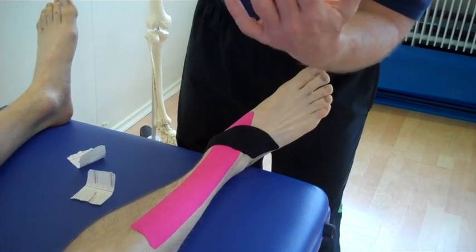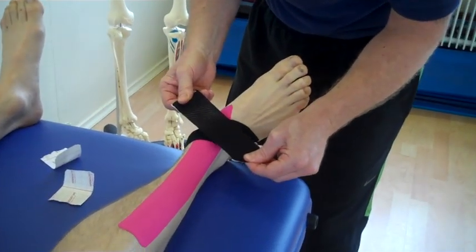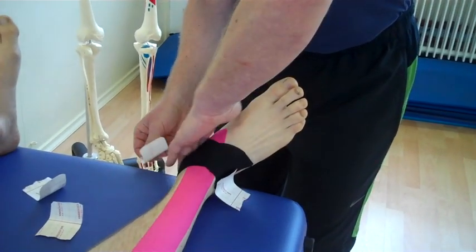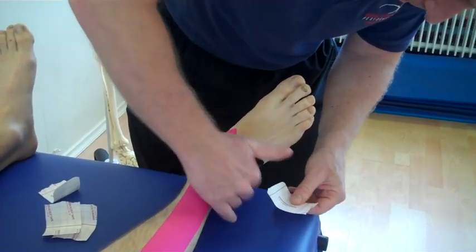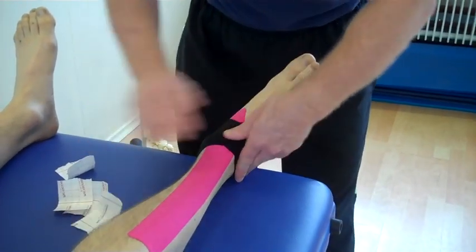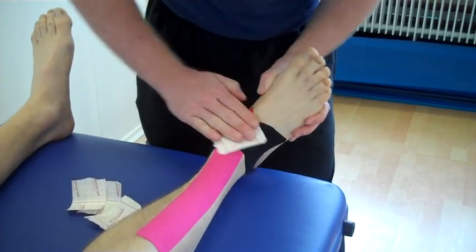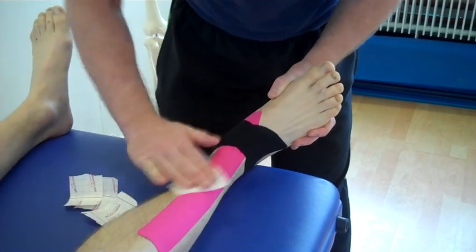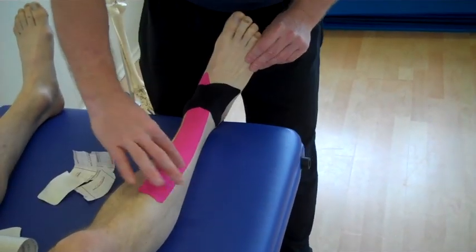Peel back, fold it over and again think of an X shape, so we're going to come across like an X shape. Medial side, mould, and again lateral side, just mould so it's an X shape. If you want, use the back of the tape again to warm up the adhesion so it sticks better to the applied foot. And there we have functional taping.